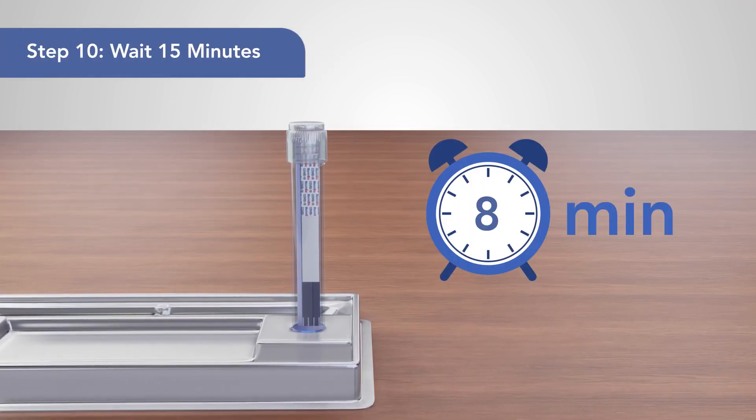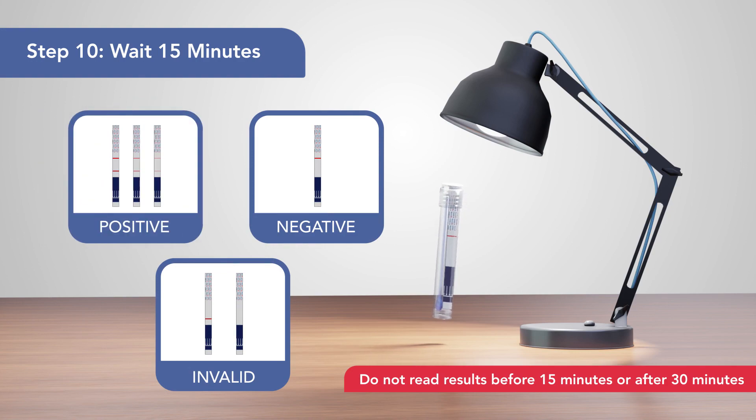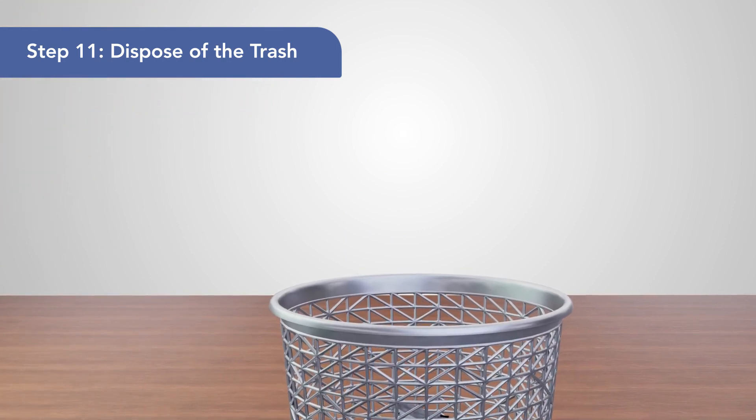10. Don't disturb the test for 15 minutes, after which read the results under good lighting. 11. All used components should be disposed of in household trash.